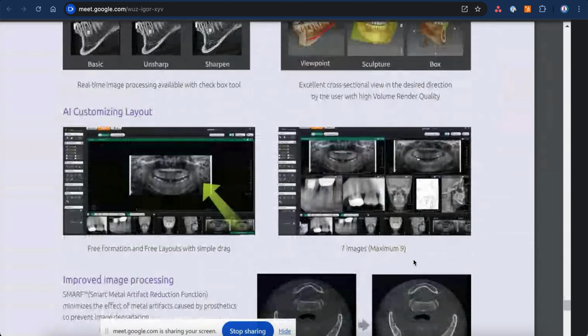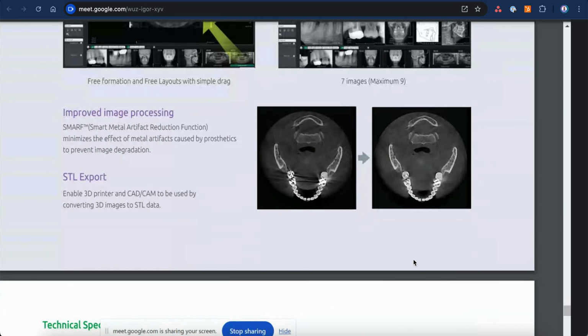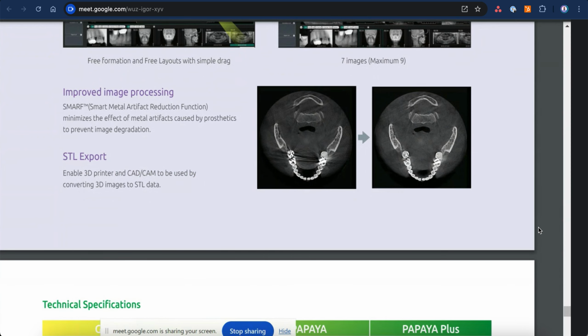This is for the clipping. This I customized. So this is all related to STL export. For example, I want to get a CAD/CAM, which is used for smile designs and to see the jaw as a whole and the segments in the colored position. I use the CAD/CAM. So here I enable 3D printing and CAD/CAM to be used. By using the STL export, this software allows me to use the CAD/CAM to, for example, build, in the case of implants, do you remember the scan abutment that I have explained before?